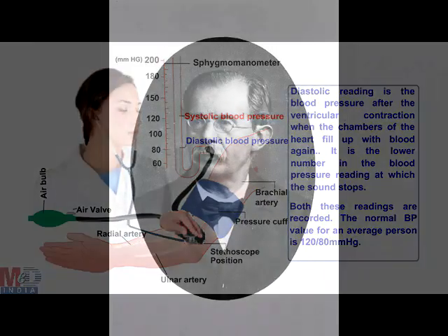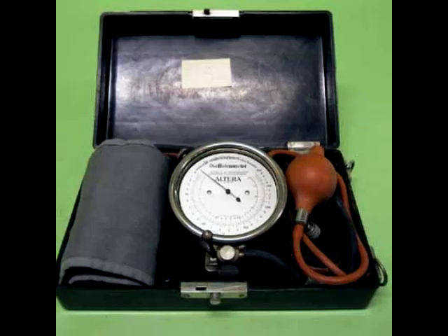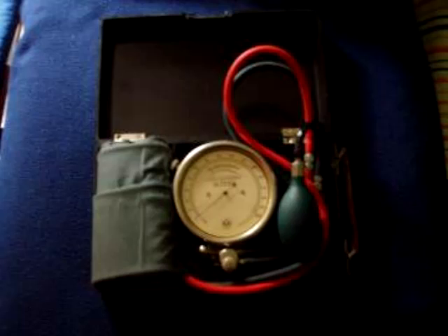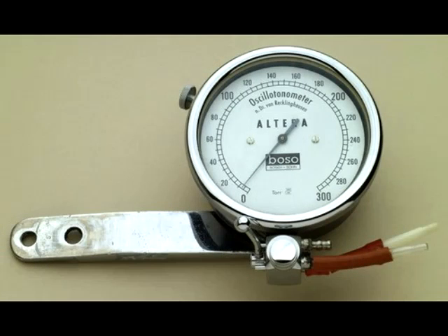Our initial ideas for the device were derived from a blood pressure measurement method developed in the 1930s by German physicist Heinrich von Recklinghausen. This device, known as the oscillotonometer, allowed for the reading of both diastolic and systolic pressure without the use of a stethoscope. It consisted of two cuffs with a pressure gauge connected to one another.